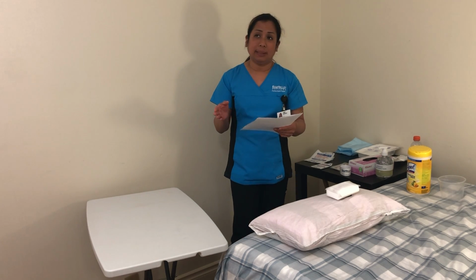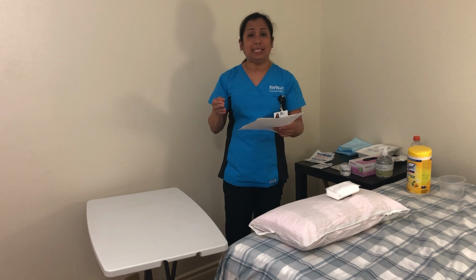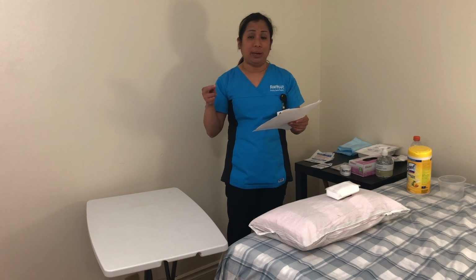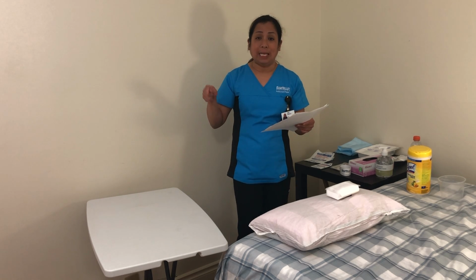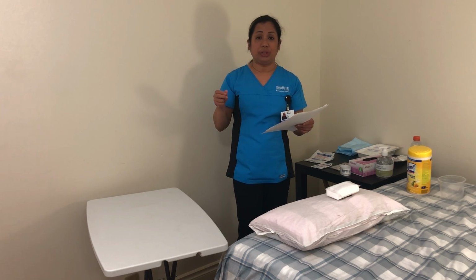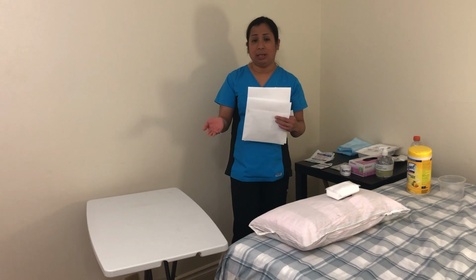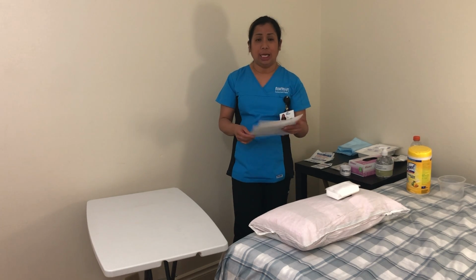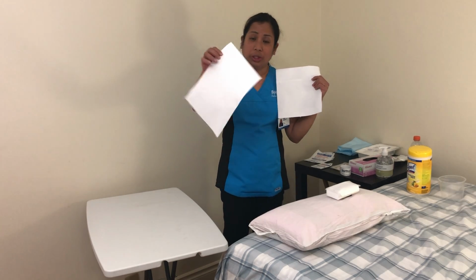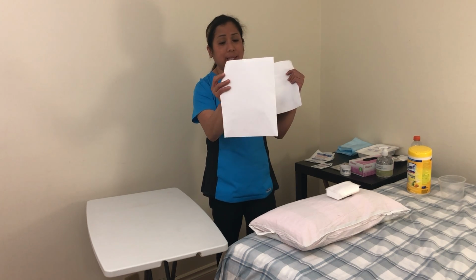The scenario is the patient's name is Michael Jordan. He has a fracture of the tibia and fibula on the right side of his leg, and the current situation is to remove the staples. Now, after reading my scenario, I will verify the doctor's order. This is the doctor's order, and this is the back of the doctor's order. I want to show you that nothing is written on the back.